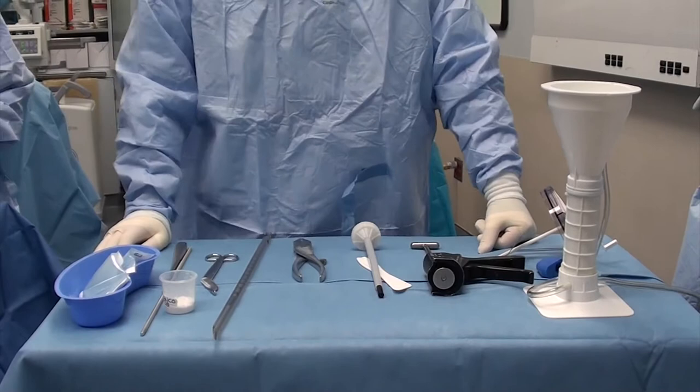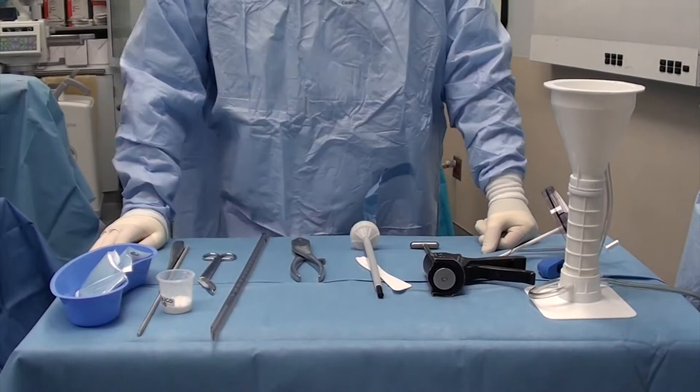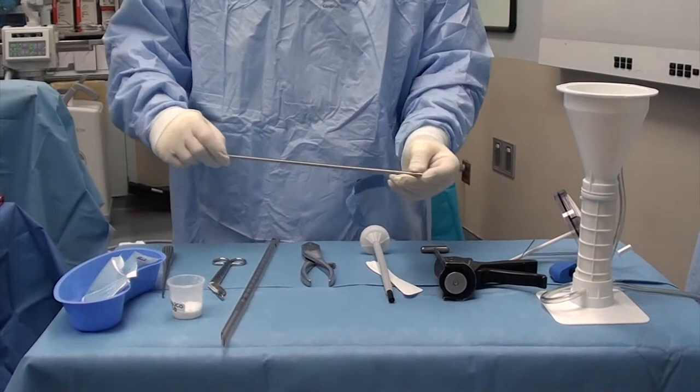We're here going to make an antibiotic femoral nail for a femoral osteomyelitis case. We know we've removed a 400 millimeter nail in the past, so we're going to make a 400 millimeter nail.